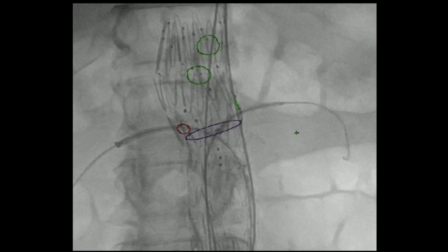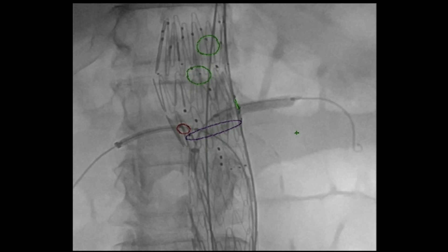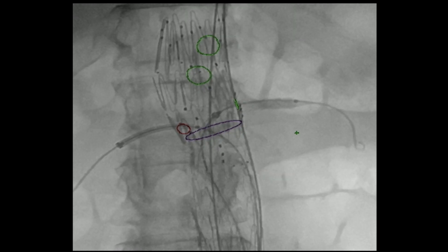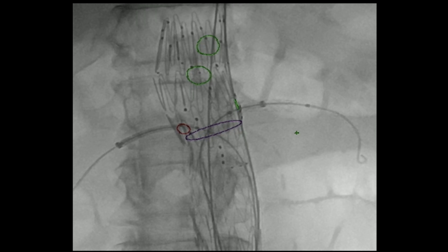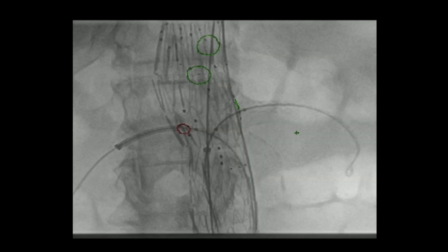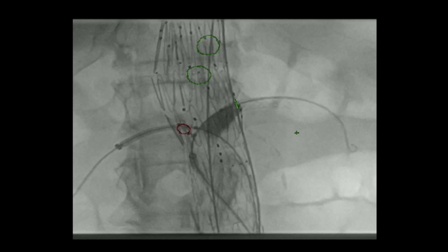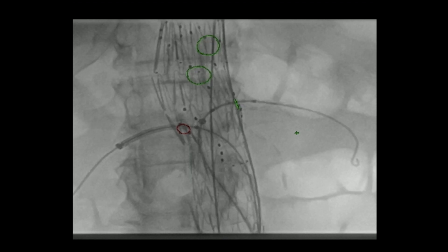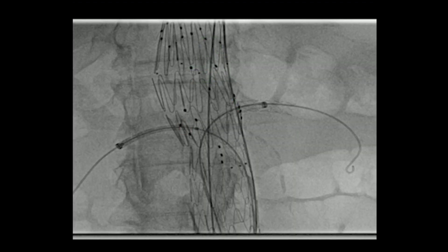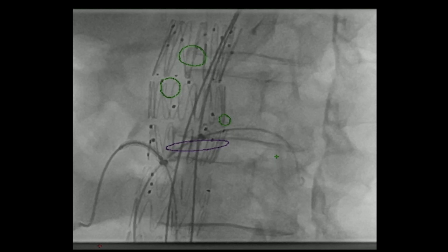The Coda has been removed. Now we're withdrawing the Ansel sheath and optimizing for the left renal fenestration — you can see it's beautifully aligned, the green circle is now aligned. We have it projecting 3-4 mm into the aorta. We've deployed the VBX and as we take it down, we re-advance the sheath. We then take a 10 by 2 balloon, barely inserted, to flare out the proximal end of the VBX. We advance the sheath up and over that balloon back inside the left renal artery, remove the balloon, and shoot an angiogram. There is no obvious evidence of a leak at the level of the fenestration.